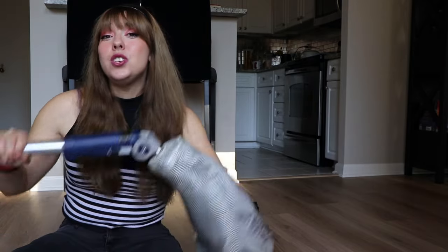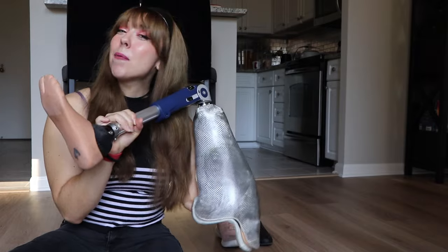While I was growing up, I actually didn't feel like I had a whole lot of options in terms of what shoes I could wear. And to be honest, I didn't. I had a prosthetic that wouldn't adapt to different types of shoes. I now do have a foot on my prosthetic that is adaptable, which means I can wear more than just tennis shoes or sneakers — and as a fashion girly, that is such a relief.